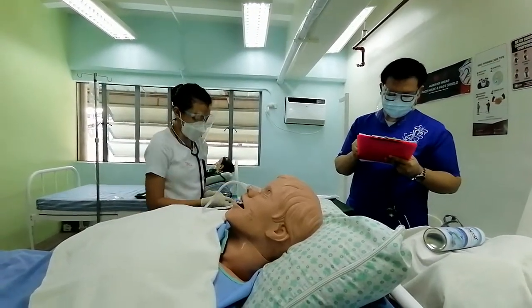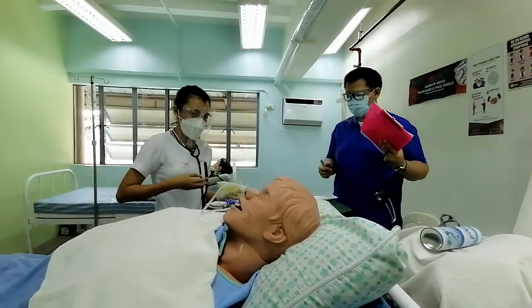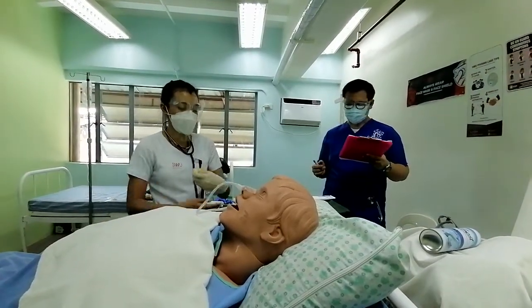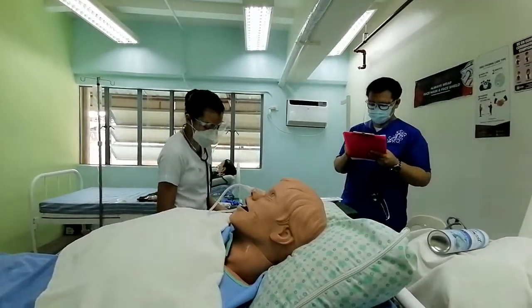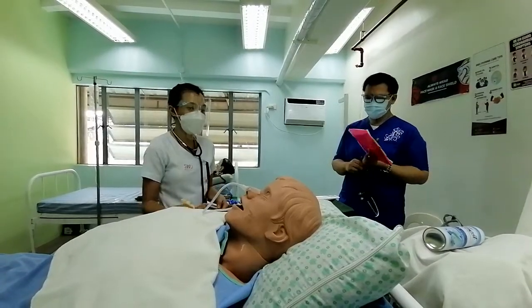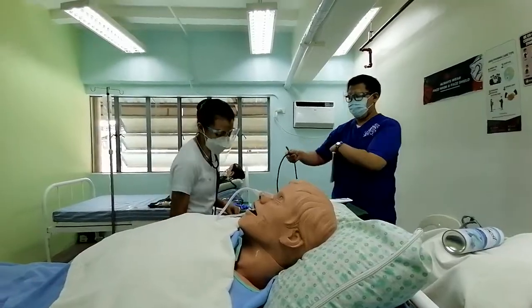This is in order to prevent cross-contamination, and then position the patient in a comfortable position, since we all know that NGT insertion is very uncomfortable, and then we provide proper documentation. The purpose of this is that this is a confirmation that we have provided the procedure to the patient, and it serves as a protection for the patient and the health provider.